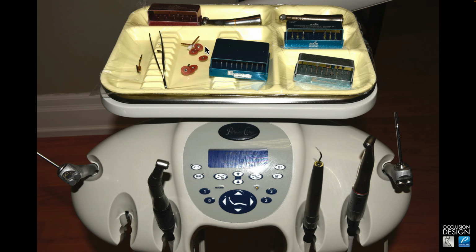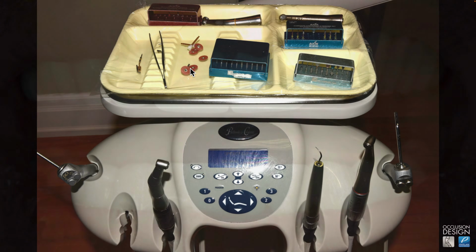Softflex XT discs are something I use for the preps to smooth them and to adjust and refine the provisionals. Most of the time I'm using the coarse. And then the Enhance cups are something that I use a lot as well, especially around implant provisionals and just to smooth and round my preps.